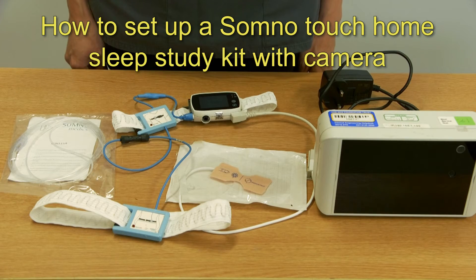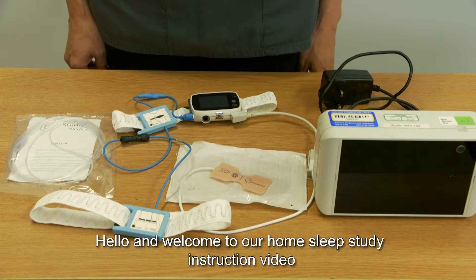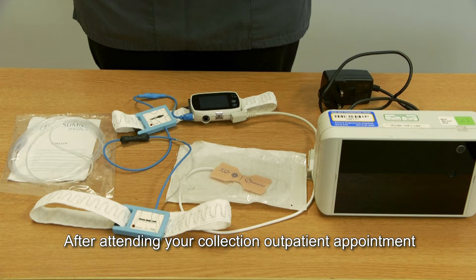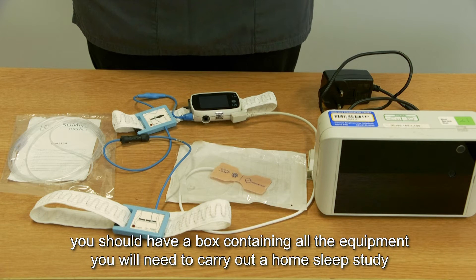How to set up the SomnoTouch home sleep study kit with camera. Hello and welcome to our home sleep study instruction video. After attending your collection outpatient appointment, you should have a box containing all the equipment you will need to carry out a home sleep study.